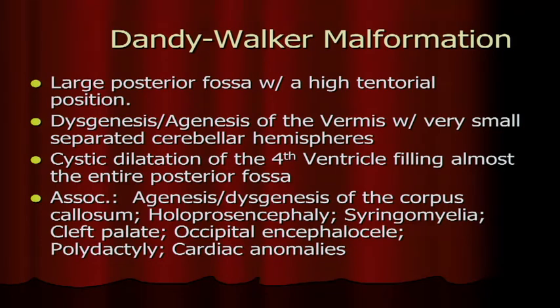What is a syrinx, guys? A syrinx is a dilatation of the central spinal canal. I thought hydromyelia was the dilatation of the central canal. A syrinx is a cord substance destruction. We often can't tell, so we call it syringohydromyelia. But hydromyelia is when the central canal is dilated. A syrinx is a CSF tract in the cord substance due to destruction of the cord.